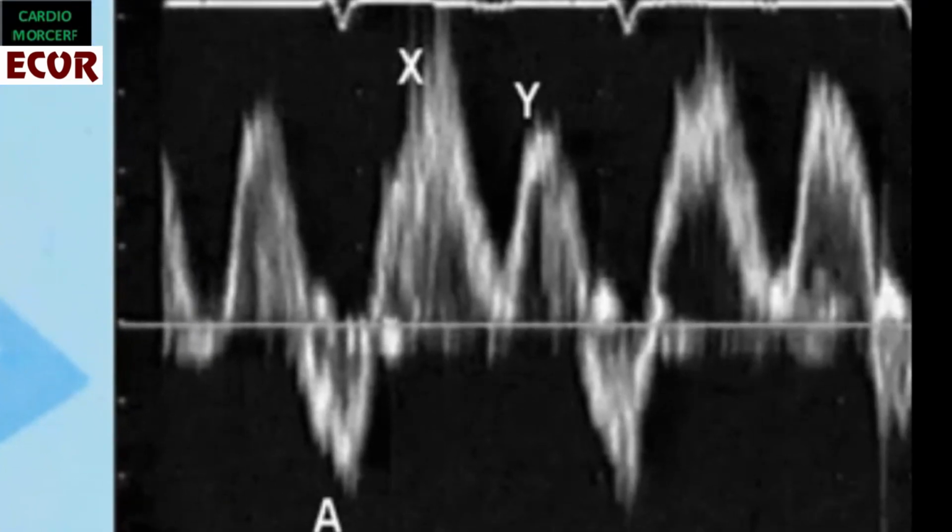During left ventricular systole, we see the X or S wave indicating entrance of blood from the vein to the LA. This is the moment of LA reservoir during the systolic period when the left atrium has its greatest size. Then, if the pressure inside the left atrium is increased, the vein will have some difficulty emptying into the left atrium, and there will be a decrease in the amplitude of this wave.